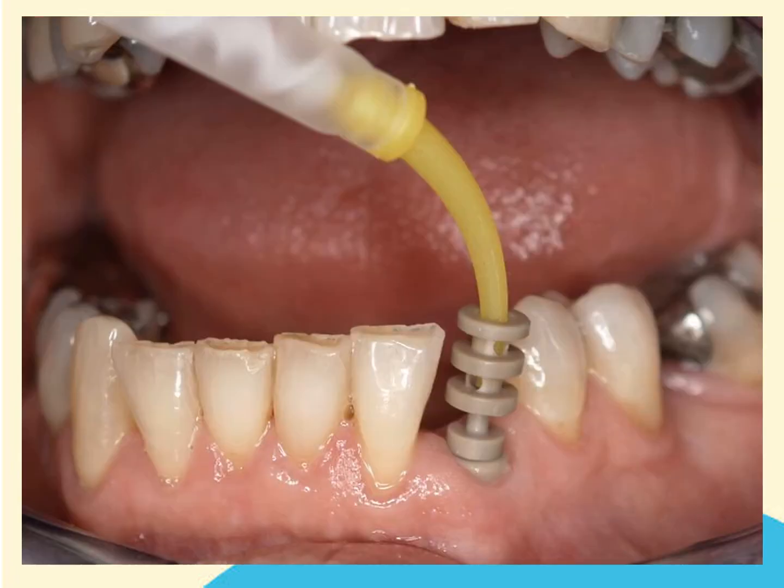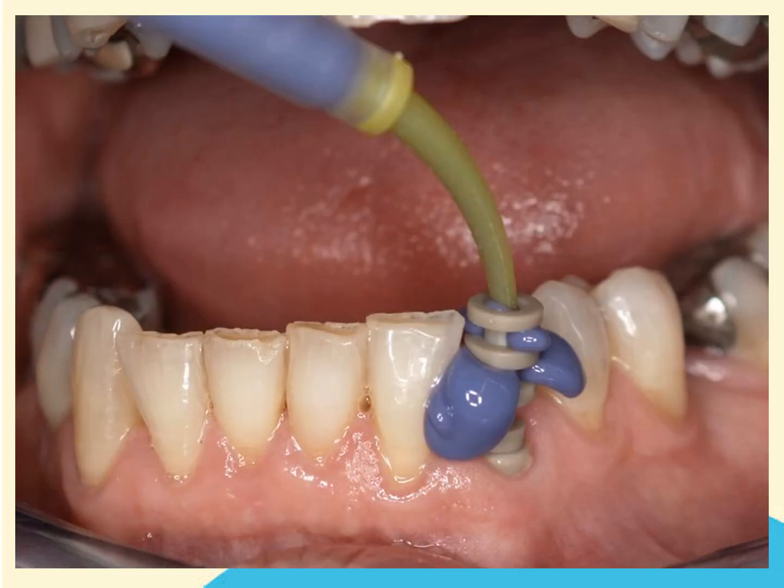The tip of the impression syringe is introduced into the top of the clicking top. The impression material is injected through the top of the clicking top so that it vents out through the side ports. It is important that you use a hard-set impression material such as Impregum Hard, a polyether — not a light-bodied silicone or even a heavy-bodied silicone, as these may either displace the clicking top or may not grip it securely enough for it to be withdrawn in the impression.